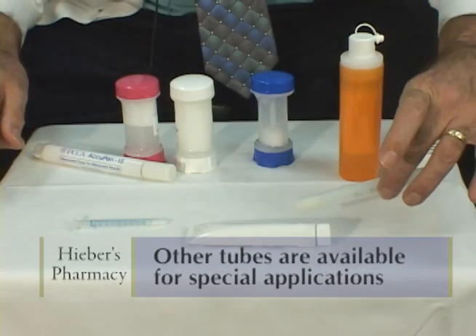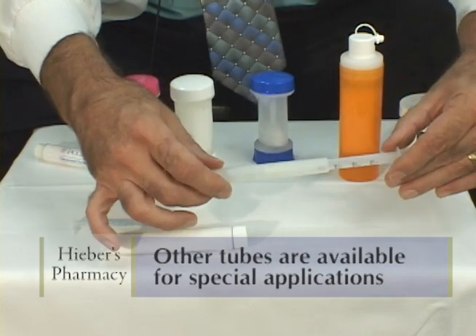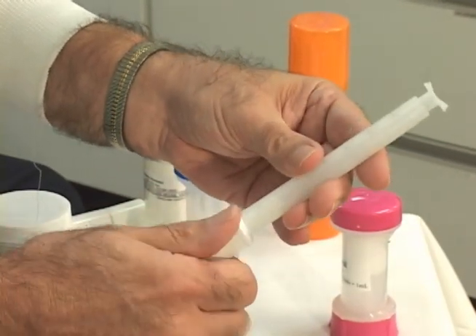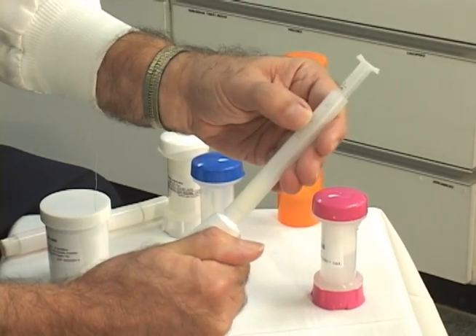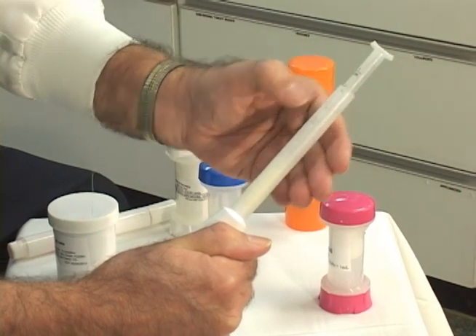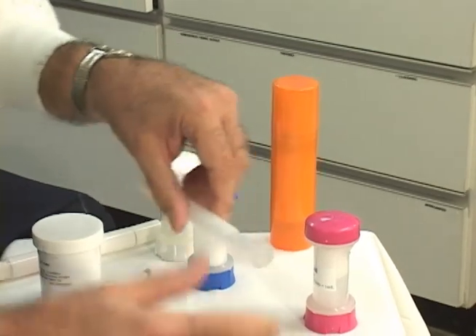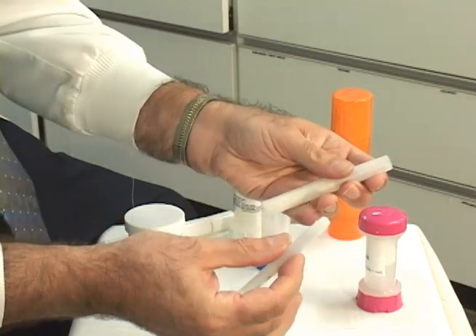Lastly, I'd like to show you that using the same type of tube we make vaginal creams and gels. We would just screw the applicator on the end of the tube, and as you squeeze the tube you'll see that the amount in grams being expressed comes up on the top here. When you reach the number as prescribed by the doctor, you would just unscrew the tube and then apply this vaginally. When you're finished, this can be washed in the sink and reused again.